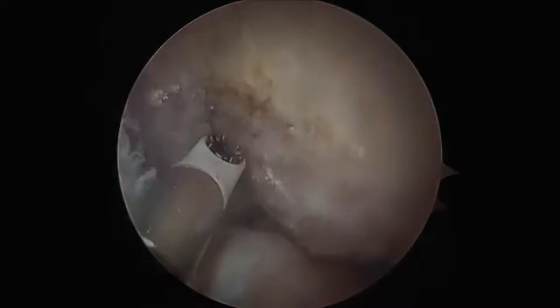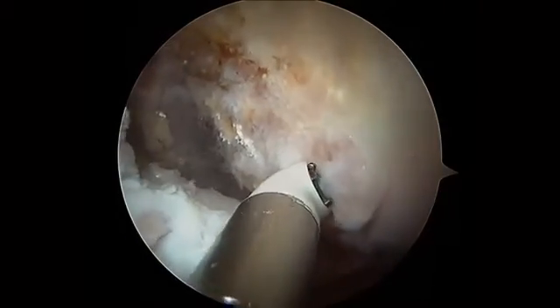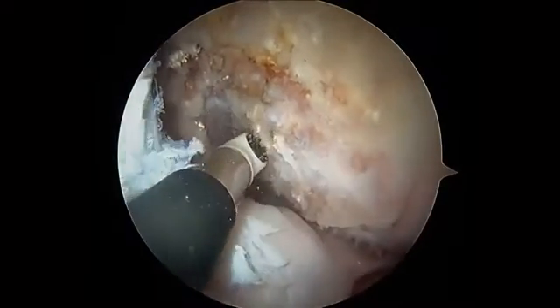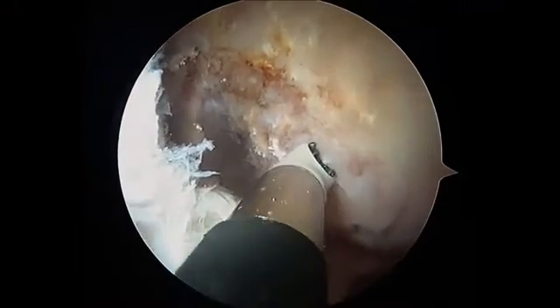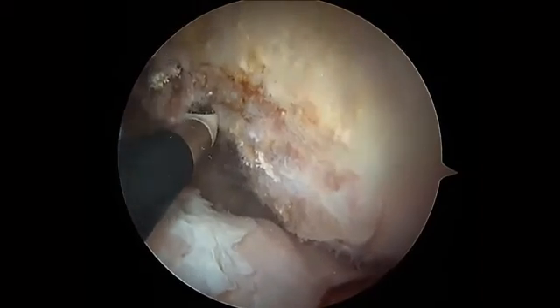Okay, I've skeletonized the notch a bit, taken the soft tissue off the notch, and I've cauterized the ACL footprint. So now you can see a little bit more clearly the entire footprint. It's almost oval or comma shaped here. And again, I'm going to go through the acronym. Let me get you oriented first.